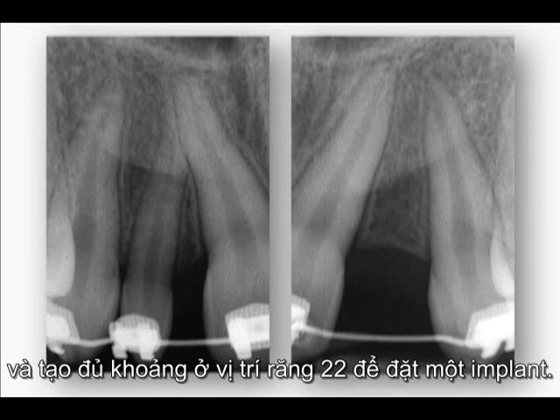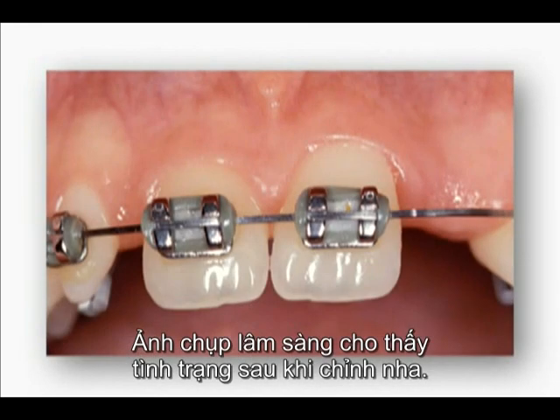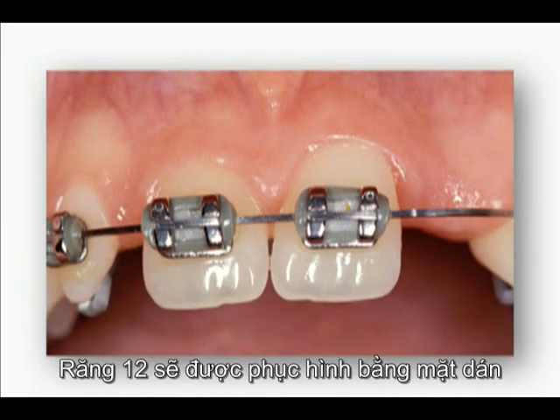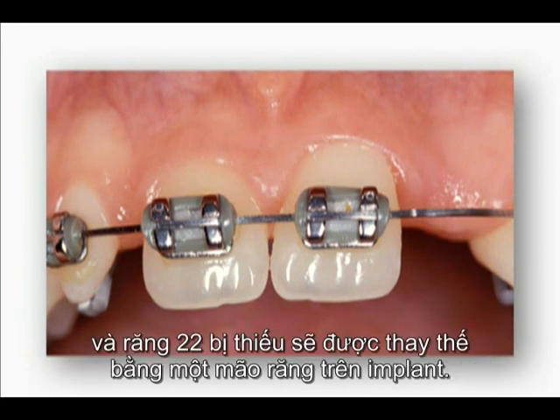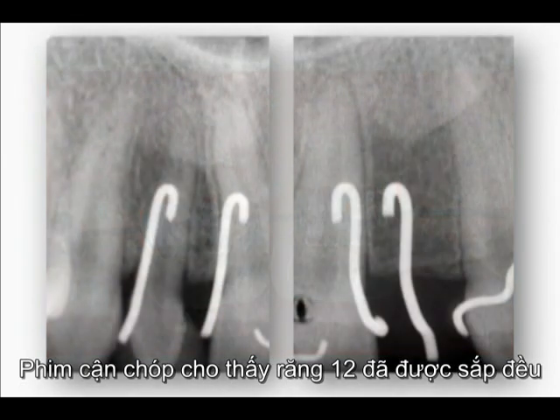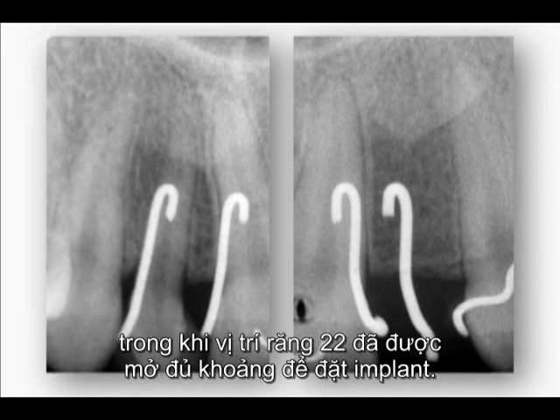implant. The clinical view shows the status following orthodontics. The teeth are now properly positioned. Tooth number 12 will be corrected with a veneer, and the missing tooth number 22 will be replaced with an implant-supported crown. The periapical radiographs demonstrate that tooth number 12 was successfully realigned, whereas the space in area 22 was sufficiently opened for implant placement.